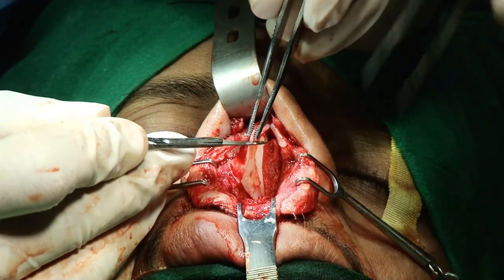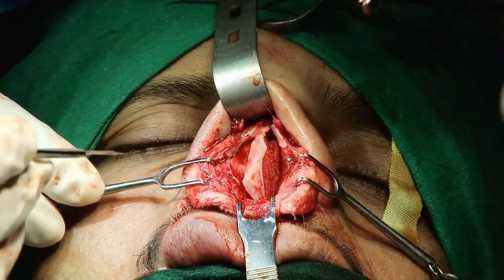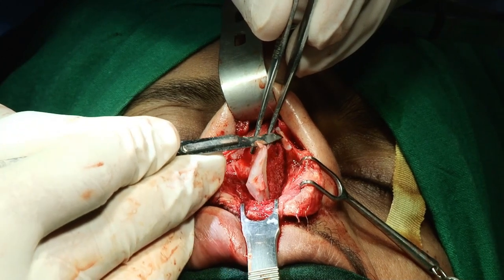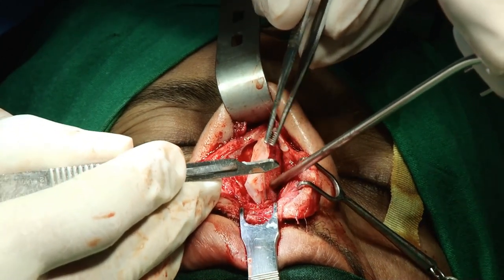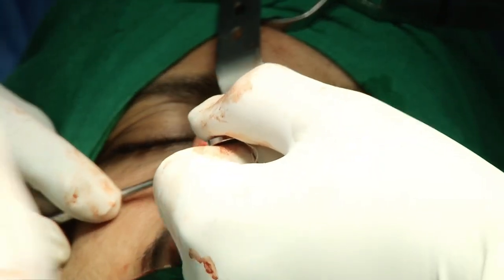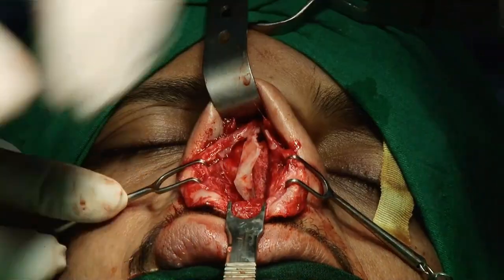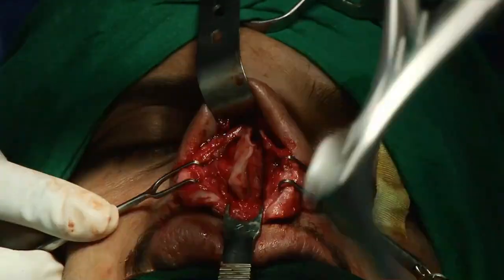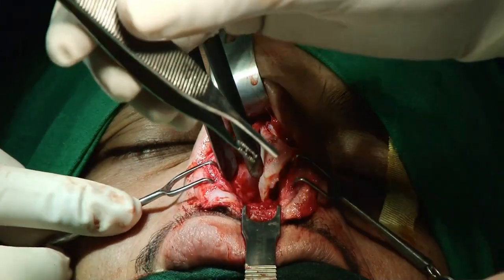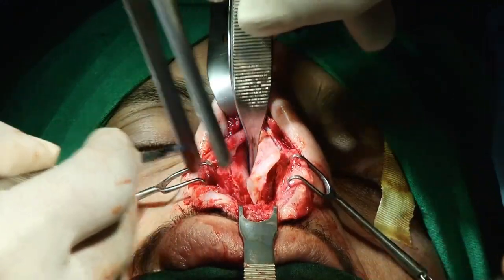So why do you excise it at the beginning instead of removing a small piece of the caudal septum so you can use that source? Yeah, because the excess part we have to remove anyway. Now we make an incision for harvesting the rest of the septal cartilage. We preserve at least 1.5 centimeters and then remove it.